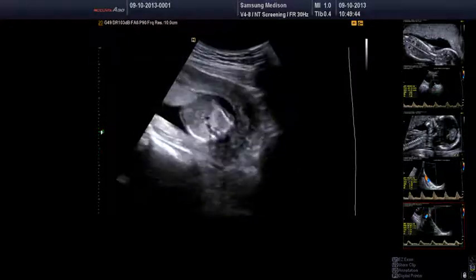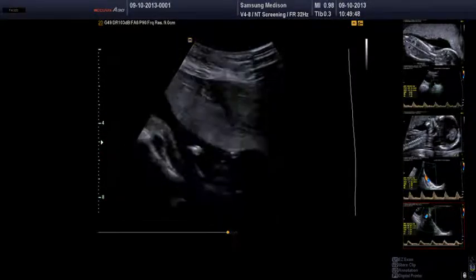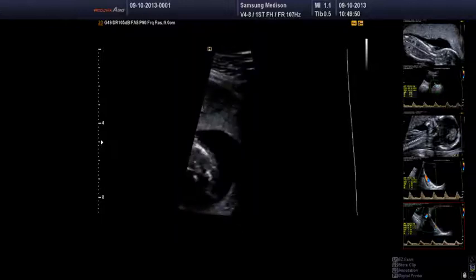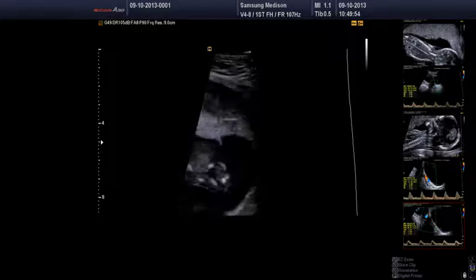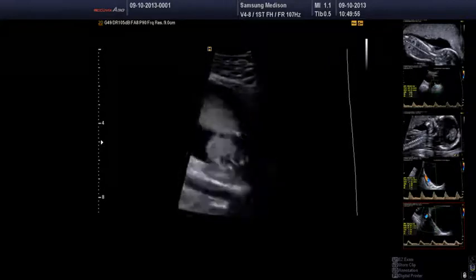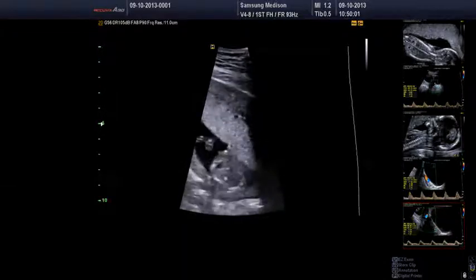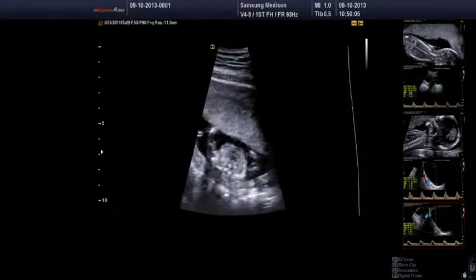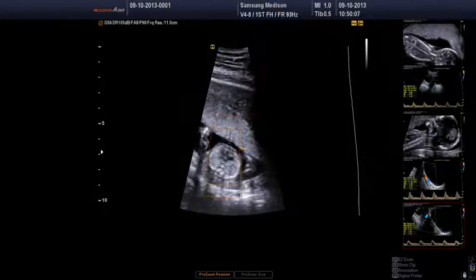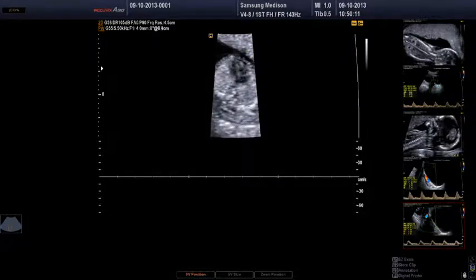Tricuspid regurgitation review. Okay, we might go to cardiac again. A quick peek at the TR. We've sort of got a little contraction anteriorly, which isn't helping me. But I'm trying to get the apex of the heart up at 12 o'clock. Yeah, just put a gate on that for me. And then what we're going to do is you can see the right AV valve, and we're going to put a gate across that.